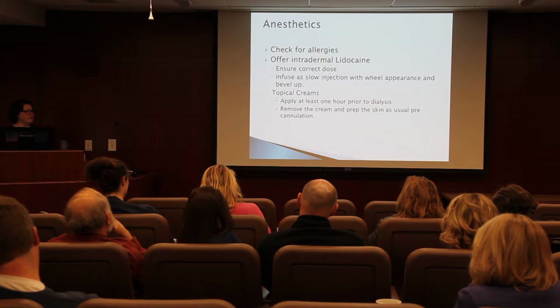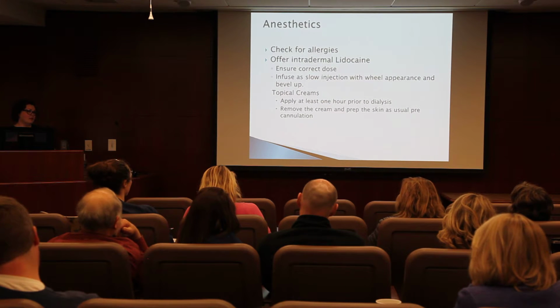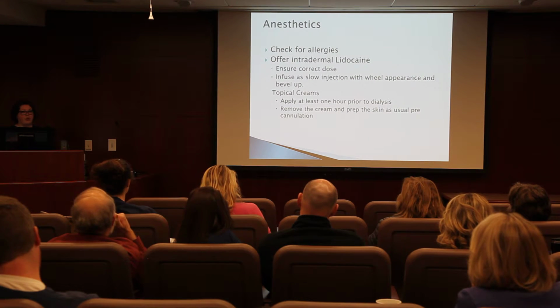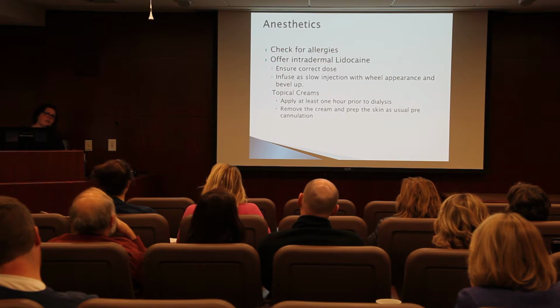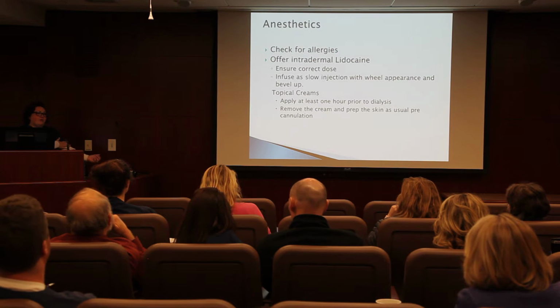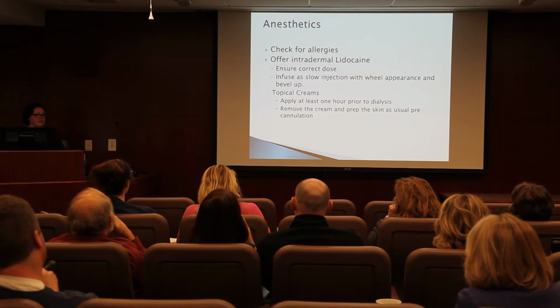I don't know if you guys use any of this stuff. Do you use lidocaine or the EMLA cream? Some patients want the lidocaine, and the slower you go with it, the less it hurts them. You want to just go right under the skin. You don't want to go into the fistula itself. You want a small wheal appearance. And I know some of our patients like the EMLA cream, but they have to put that on about 60 minutes prior to coming in. A lot of them wrap cling wrap or saran wrap around it. So just wipe that off with a wet cloth and then do your scrubbing.